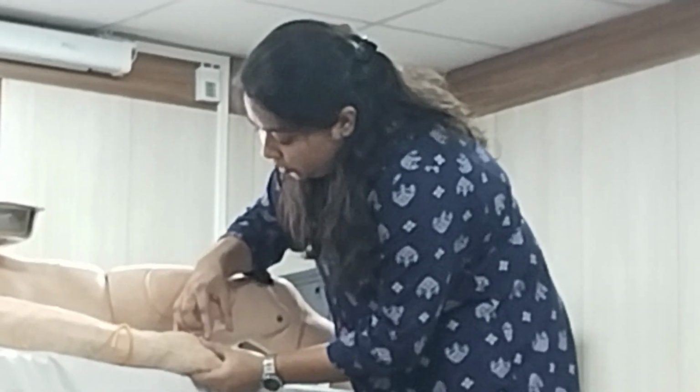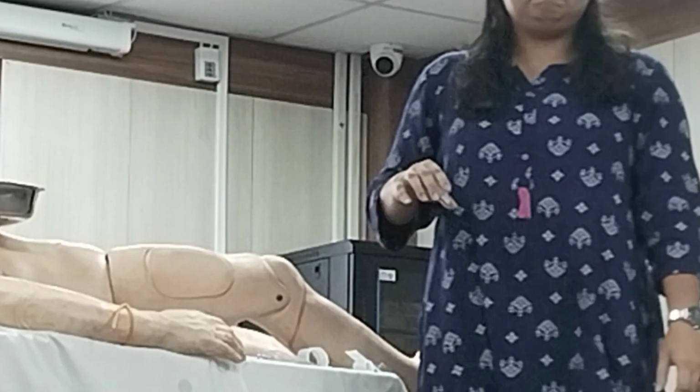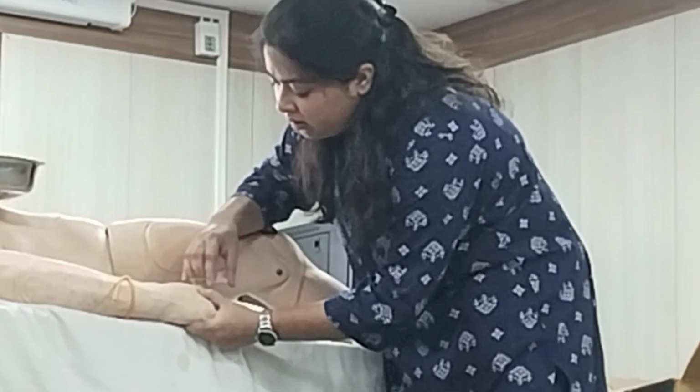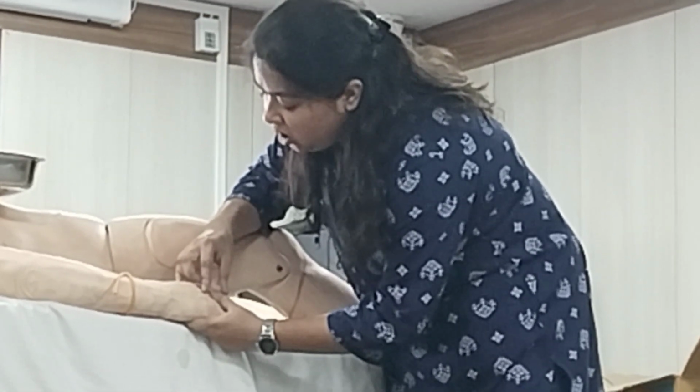Then pull the skin a little so that the veins do not move away. Exactly. In elderly patients, that's why it is very important that you stretch the skin of the patient, and then you introduce the cannula.